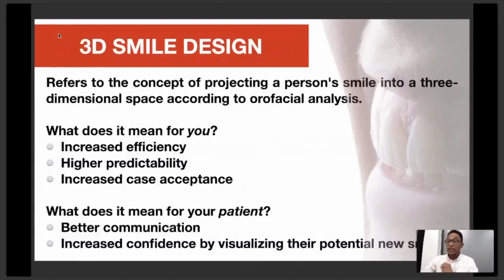What does it mean to your patient? So when you design a 3D design and bring it to reality, it means that you now have a better communication with your patient. And now you get increased confidence. And what does that mean? It means that your patient now gets a higher confidence in your work because now the patient can see their potential new smile.